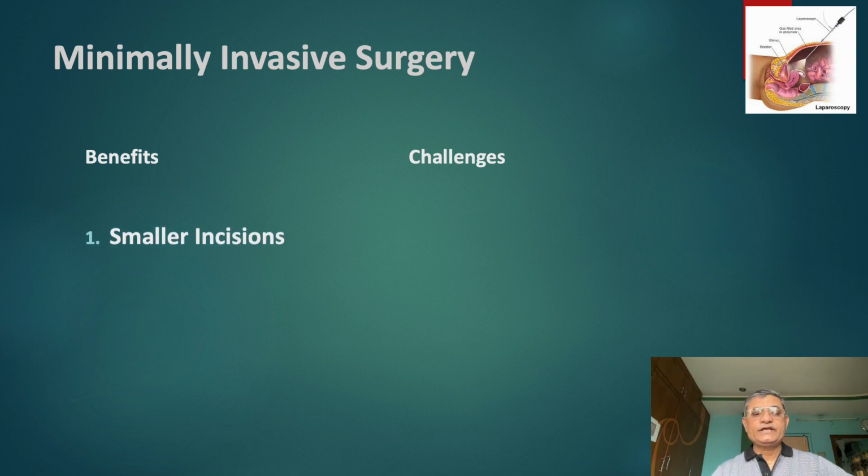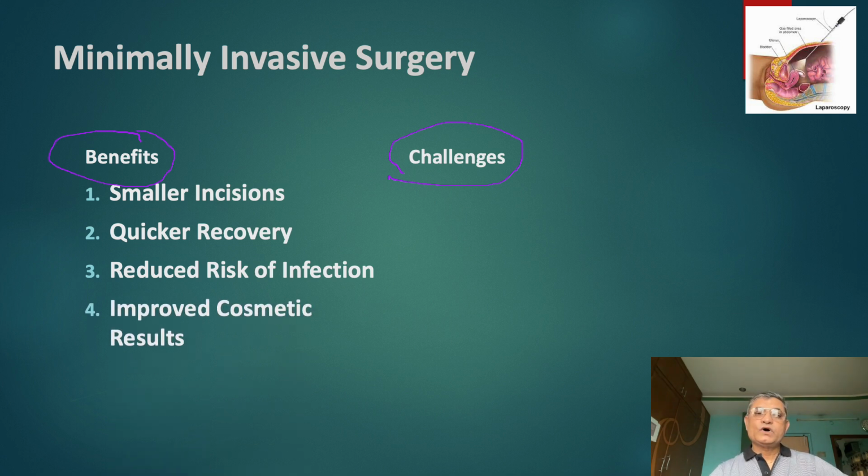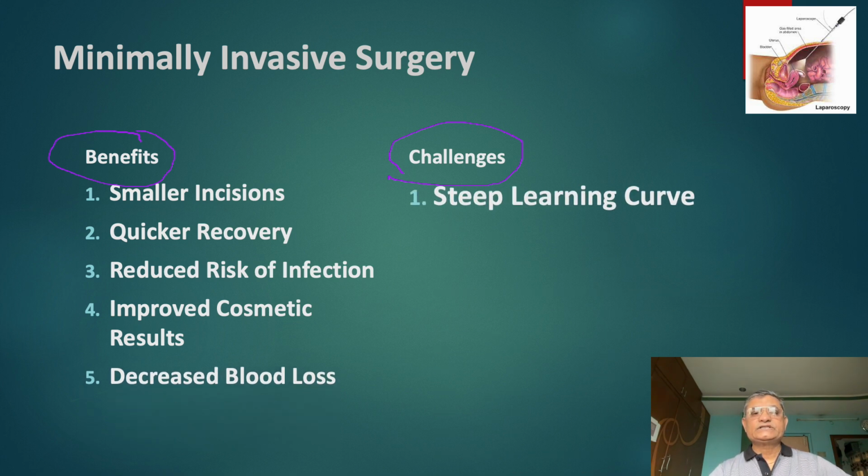So we have learned the benefits and disadvantages of minimal access surgery. The benefits are smaller incisions, quicker recovery, reduced risk of infections, improved cosmetic results, decreased blood loss.